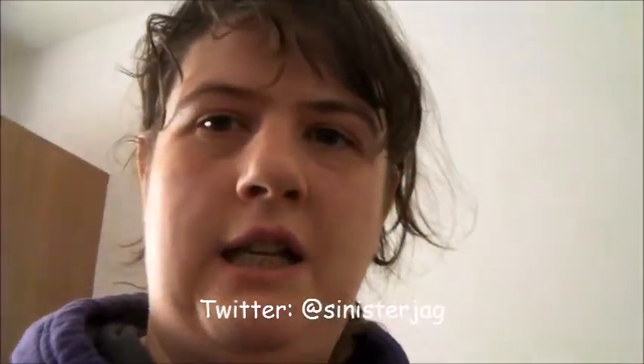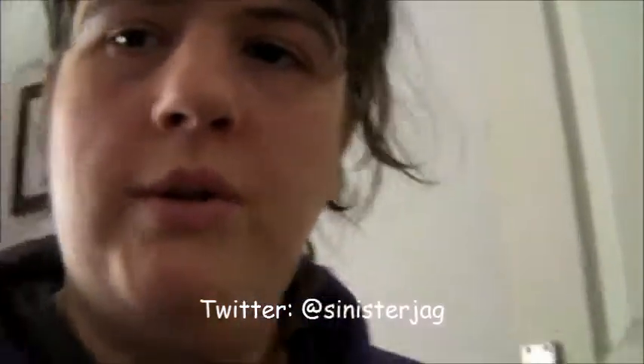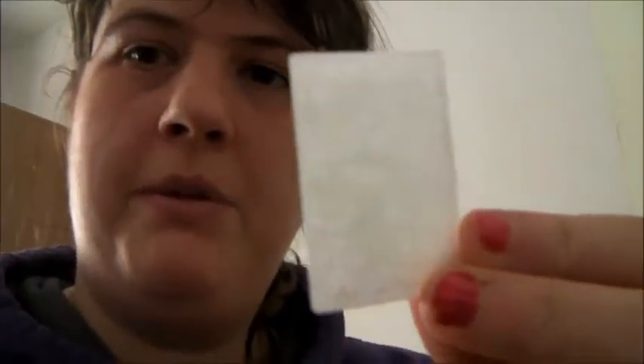Hey everyone, it's Synth and Jack here again today, and today I'm going to show you how to replace your air filters on the CPAP machine.